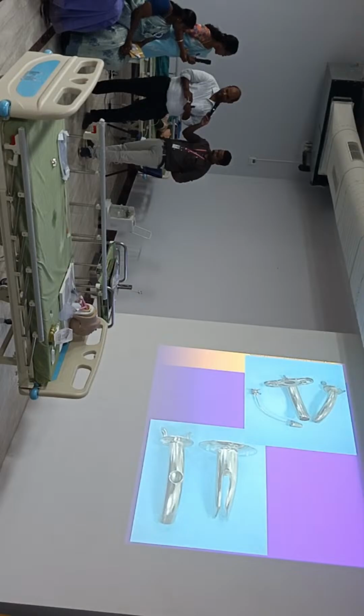So it has two flanges. The inner tube can be taken out in case there is a block, and still the airway will be patent. And the inner tube has a fenestration, so if the patient wants to speak, he can just occlude and then the patient will be able to speak.